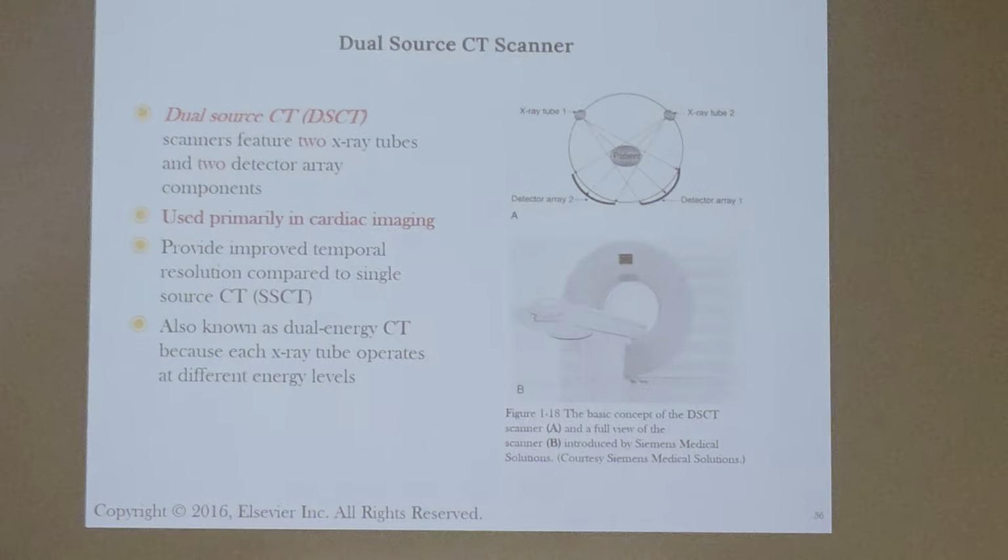So, great question. Do I have to have a dual source CT because I'm doing a heart study? No, you don't. There are other types of software, gating, or protocols that will go back and do a time sequence to say, hey, I'm in between. Usually those patients are tied to a blood pressure machine and EKGs, which determine the sequence of the heart, and that's what programs the scanner to take the images in between. We do a lot.